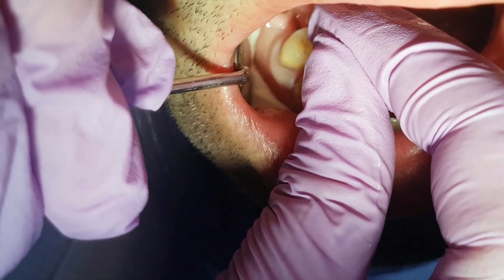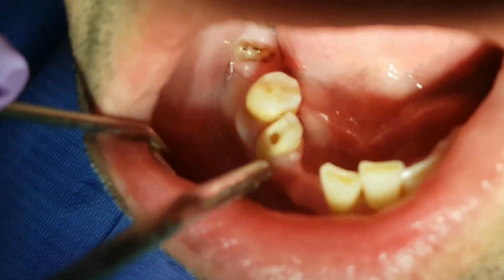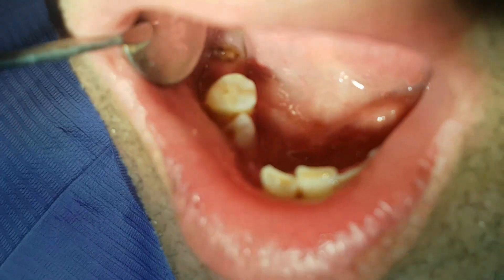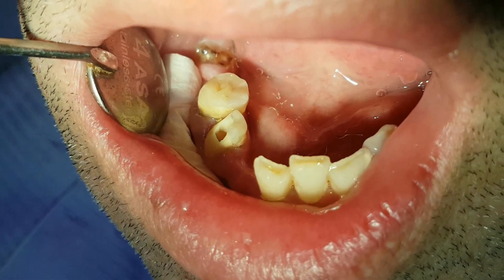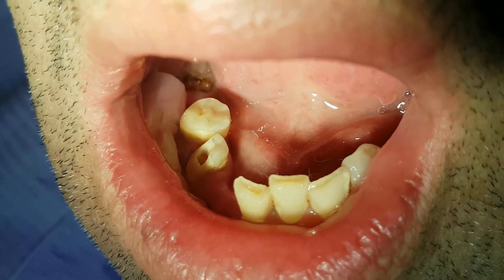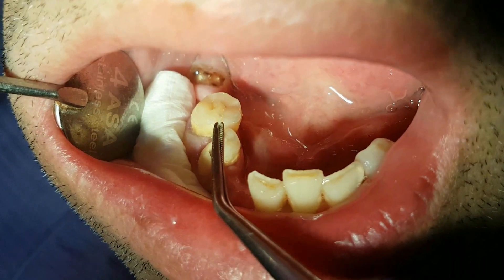We check again if we have finished the extirpation phase correctly. We dry the cavity and next we apply Solucio Klumski, because it has an antiseptic effect and will prevent aerobic bacteria from spreading. We do this to prevent infection from spreading to the periodontal tissues. We apply it on a paper point and put it in the root canal.